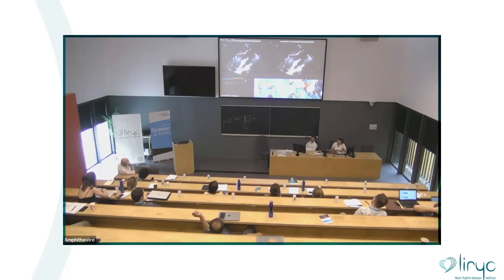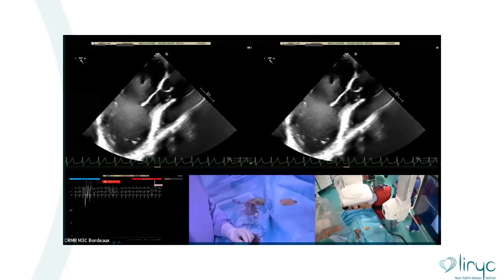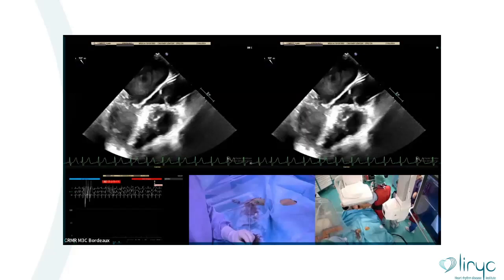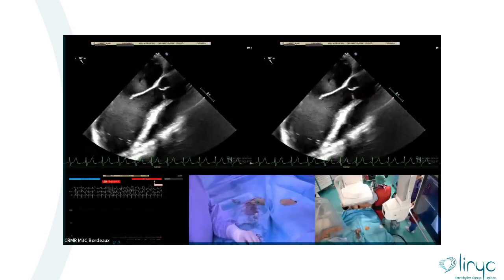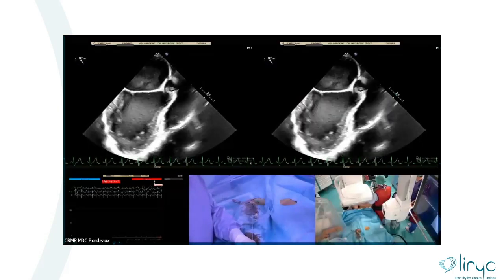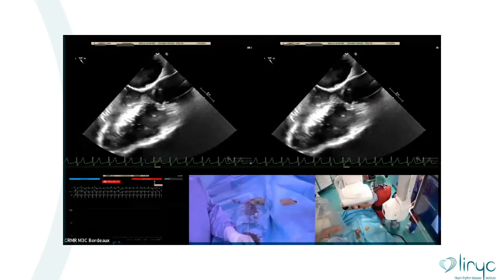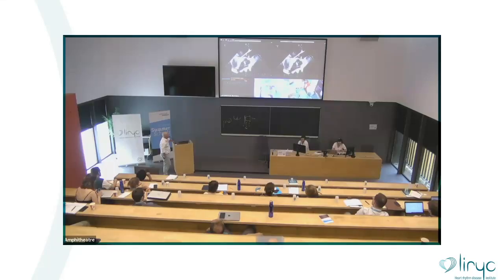Mark, what kind of guide wire do you usually use for crossing the VSD? We use Terumo, the 0.035, but you have different stiffnesses in that. And so we use the rather soft one. It is a soft one, yeah. But in fact, the difficulty is to see the orientation because echo is not so easy.